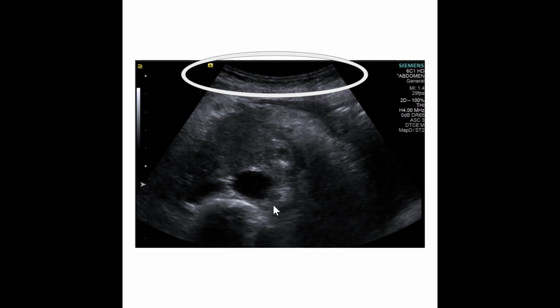Reverberation can happen at any point. We actually get reverberation right at the top of our screen. We don't actually have two reflections right at the top of our skin line. We actually have some reverberations happening in this area. So the first one is a true reflection. The second one is then reverberation between the transducer and the skin line. And if we could look really closely with super eyes or something, we'd probably see more reflections in that same pattern going down, but they are going to attenuate relatively quickly.